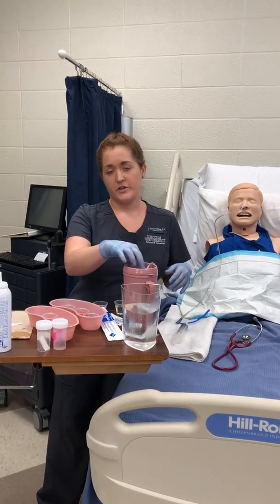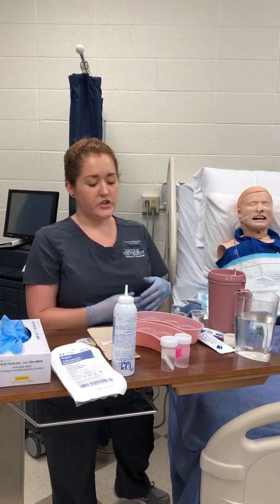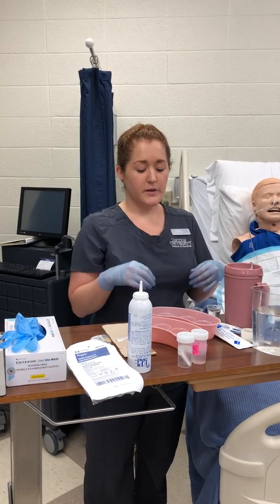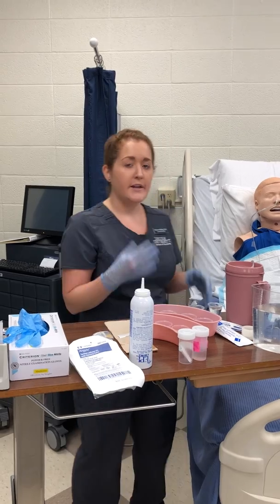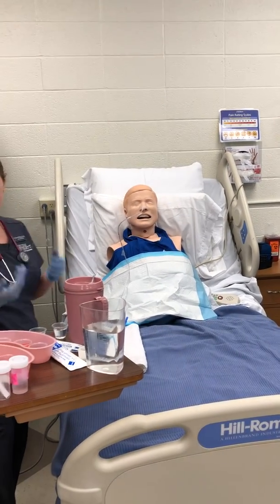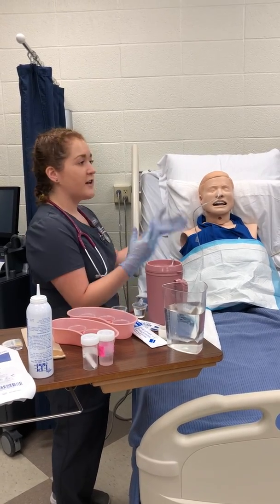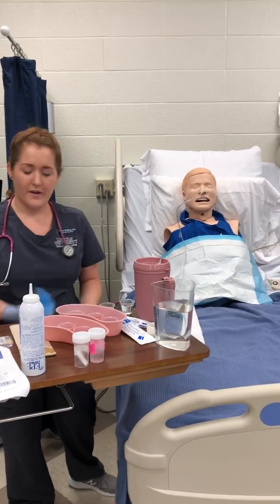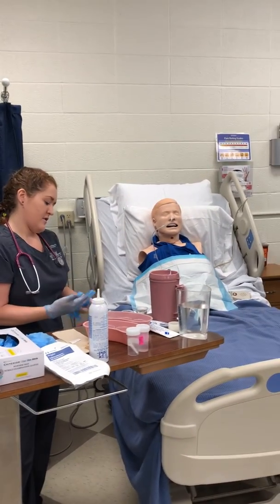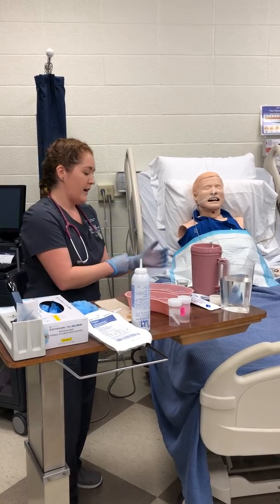For medication administration, I'm going to demonstrate how to administer two different medications. I do have them prepared already. You have to ensure that the medications are able to be crushed and dissolved — you dissolve them in about 20 mLs of sterile water. You want to do all of your medication checks and verify that it's the proper medication before you enter the room. I'm going to walk in, assess the client again, explain to him the need for the medication and why he's receiving them, identify the patient with two identifiers again, introduce myself, provide privacy, perform hand hygiene, and apply new clean gloves. Before administering medication, you do want to make sure that you're checking placement, so that you don't administer medications into the lungs, for example.